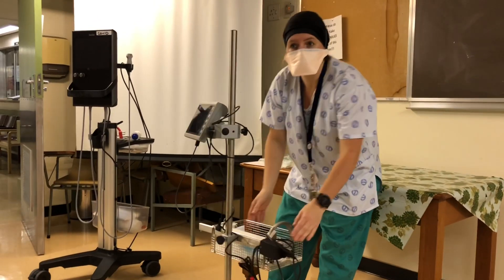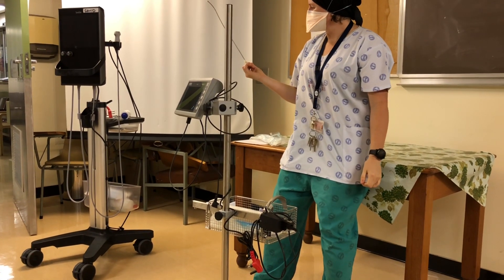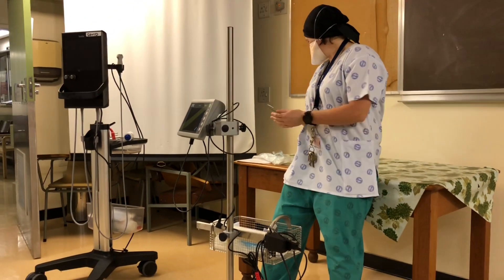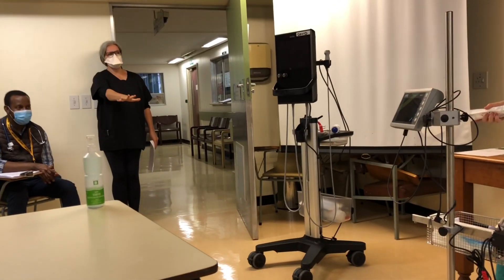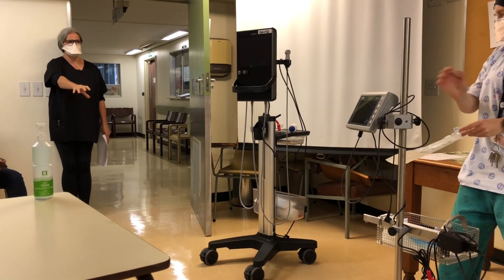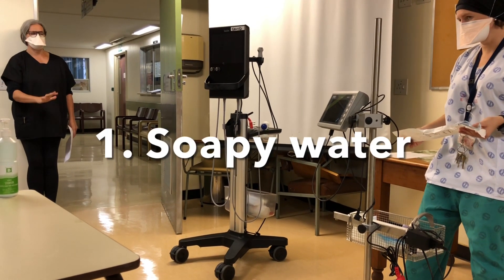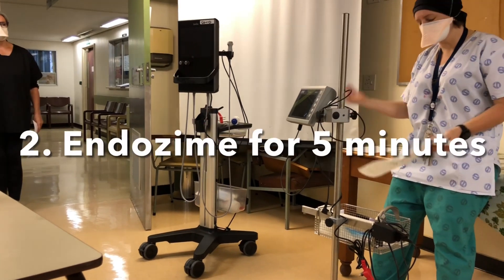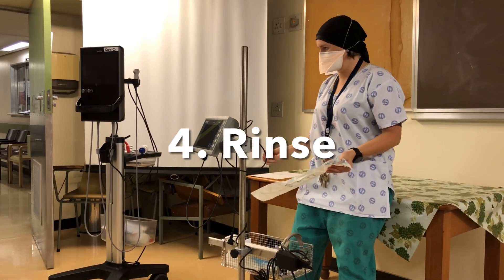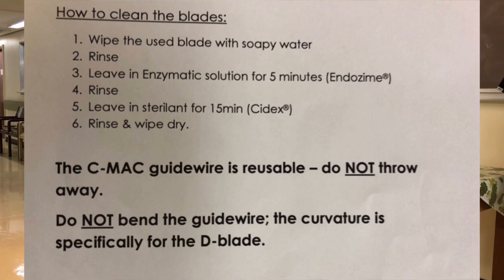Any questions? Regarding the guide wire — do you put that in the Endozyme as well? Yes. Just to recap: soap and water first, wash it first. Endozyme for five minutes. Check it, make sure there's no gunk on it. If there's gunk, back in the Endozyme, wash it off again. If it's clean, rinse it off. Then Sidex for 15 minutes. After the 15 minutes, rinse it off — it's important to rinse it off because Sidex can burn a patient. In theatre we leave it to five minutes for Endozyme.